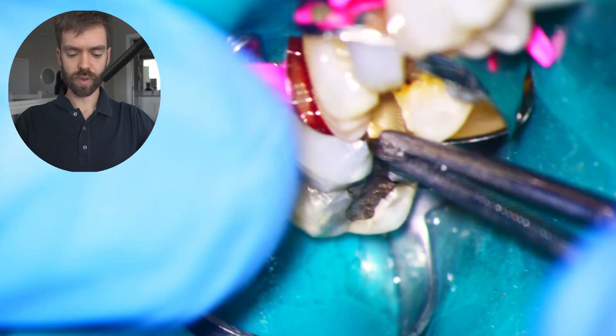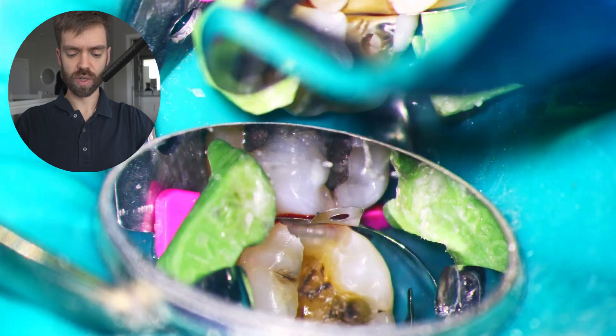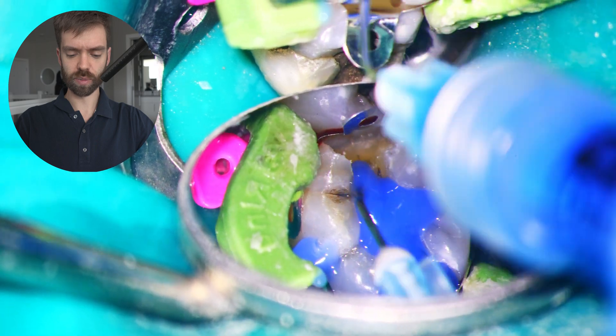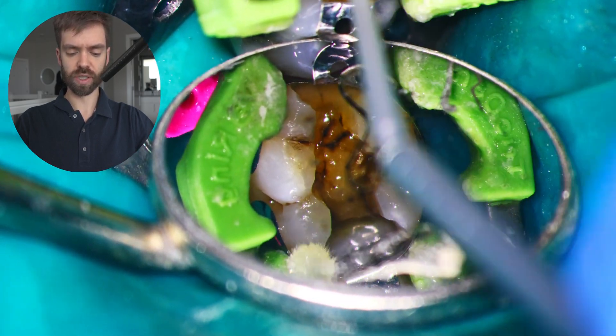We need to start building it back up. So these are some retaining walls that I use to keep the filling material in place. We're going to be using a white composite material. These green little rings just hold everything in the correct position so that when the material goes in, it has the proper contour or at least close to it.